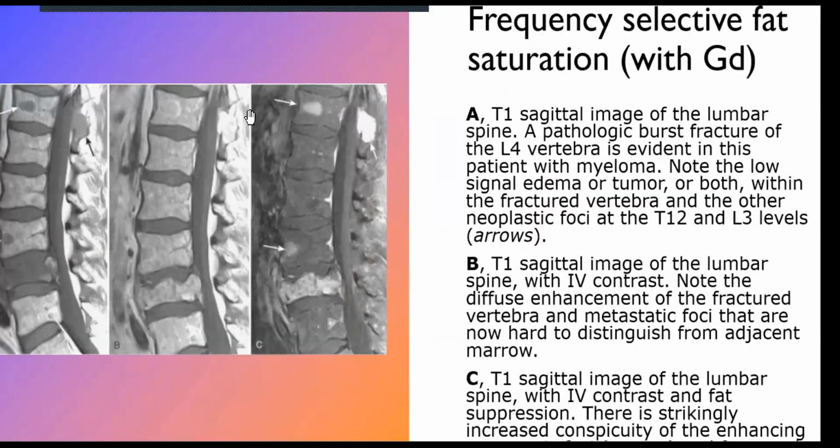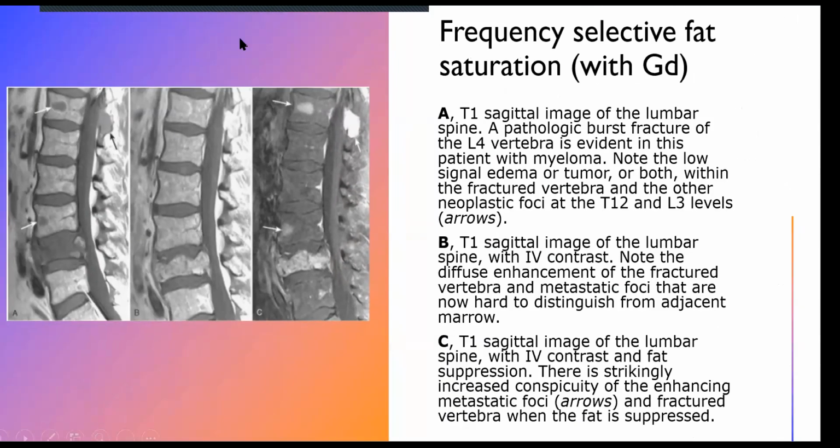So what about the frequency selective fat saturation with gadolinium? Now, you can see the first image here is T1, according to the CSF, and here still we have a T1, but here we can add a T1 also with the gadolinium.